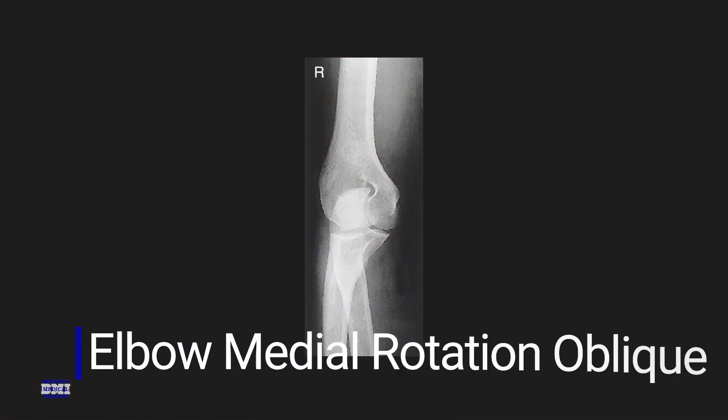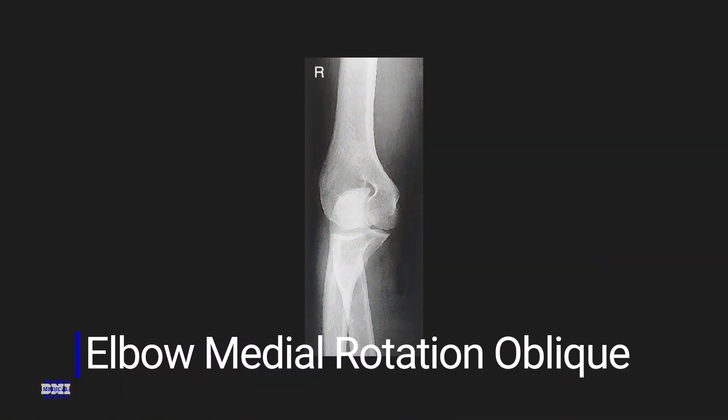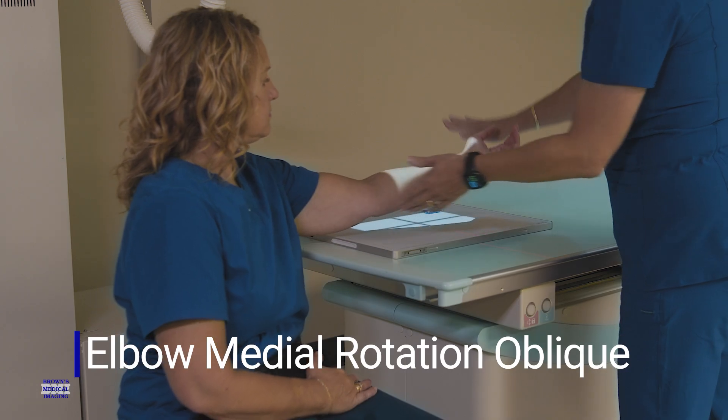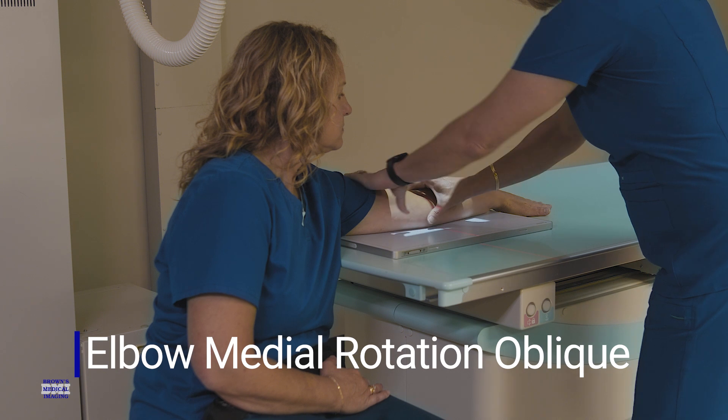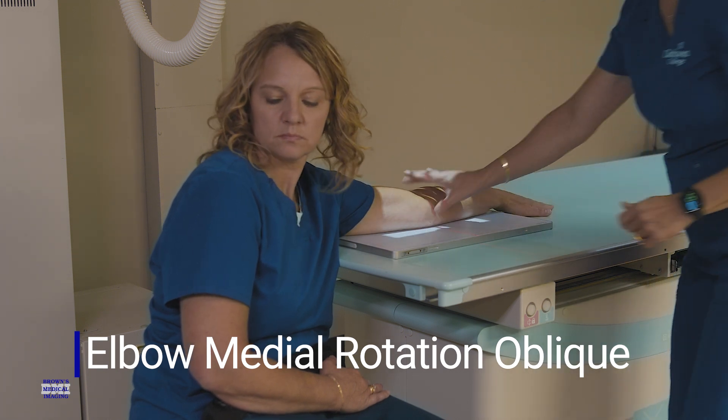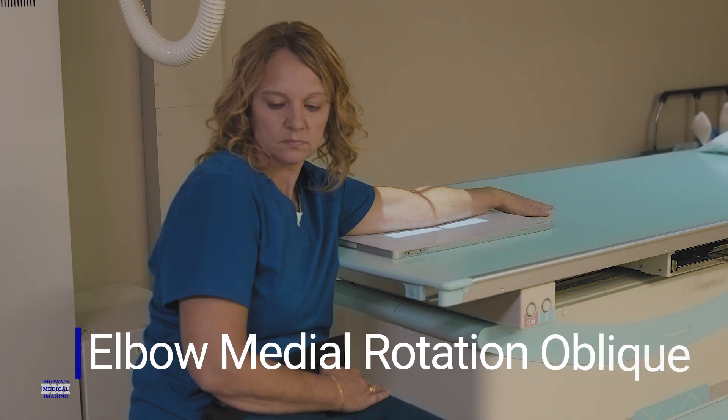Our other oblique that can be done is the medial rotation oblique. It's not as common, but it is much easier for the patient because they rotate their arm medially, meaning their palm surface is going to be down on the table, and you can palpate your epicondyles to see that they're 45 degrees. This image is going to best demonstrate the coronoid process free of superimposition.